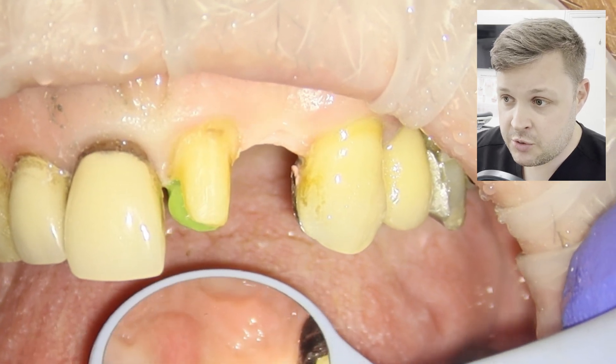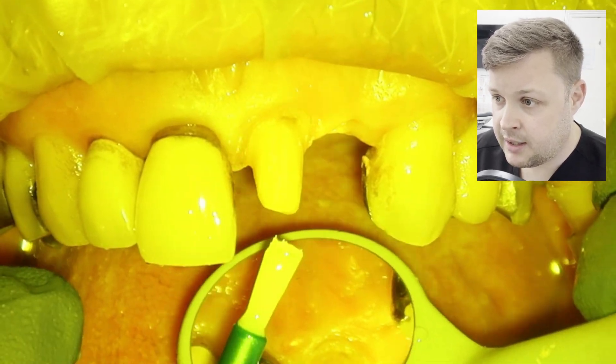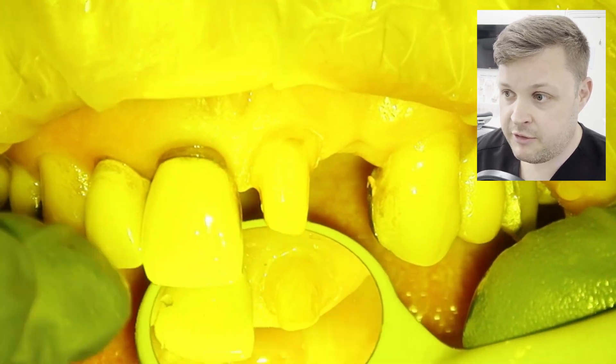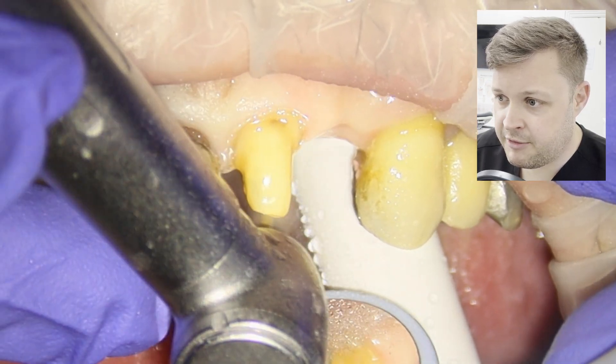I'm going to fill that cavity in with normal composite — nice and easy: etching, bond, and just place it in. After etching and bonding the tooth and filling, I'm going to give it a little prep with that fine diamond grit burr.